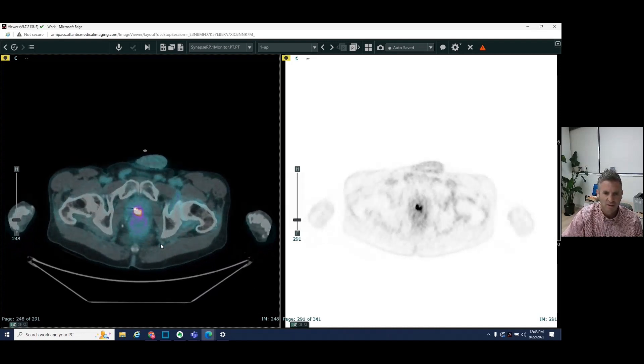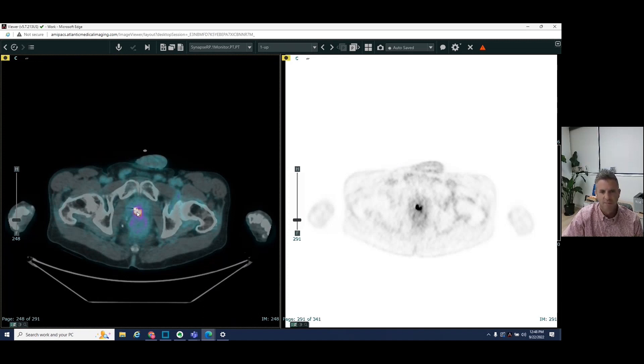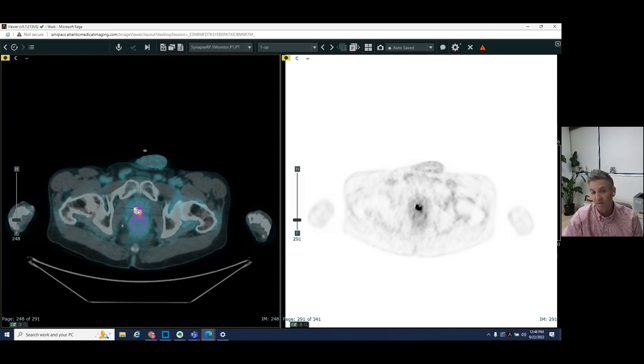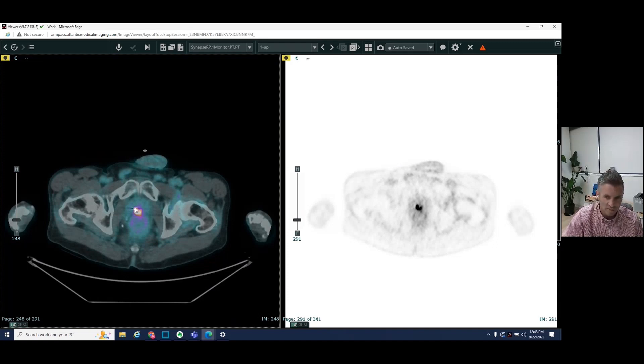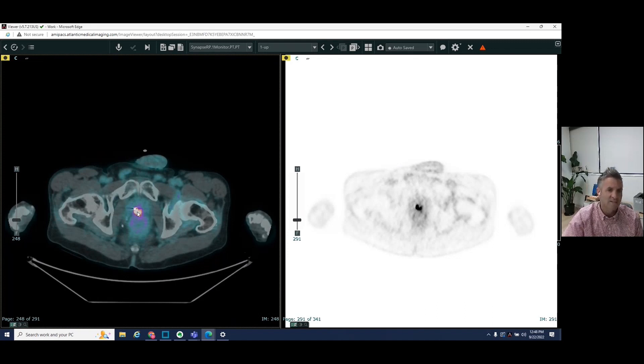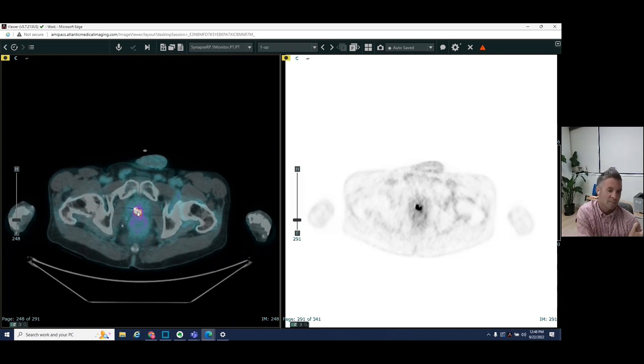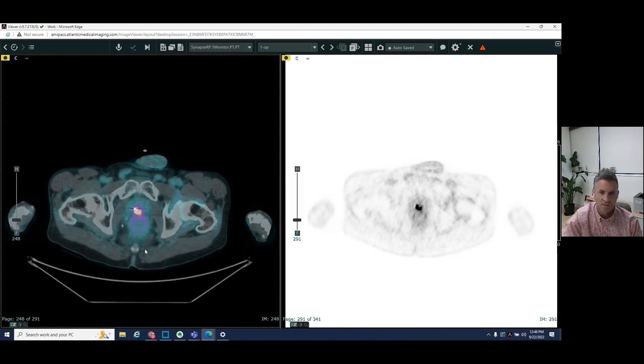You can see this is local recurrence in the prostate bed. This is where, you know, again, we may be able to see this if we did a prostate MRI. We could see a tumor nodule here or abnormal signal in that MRI. We do see that here on our PET CT, but we would not have been able to find these other areas in the chest or in the thoracic spine.